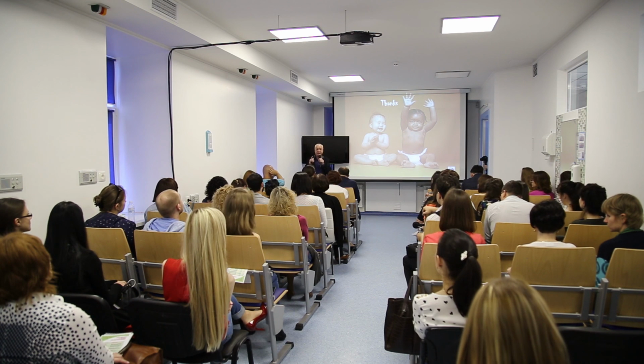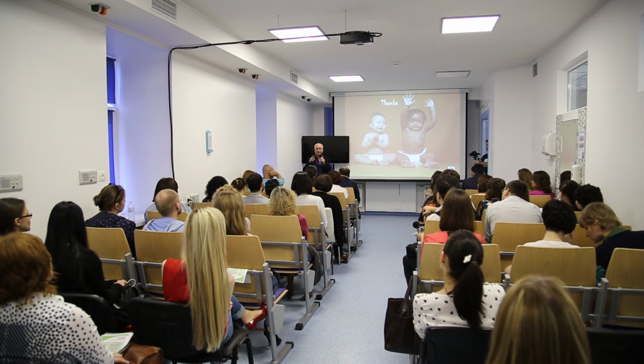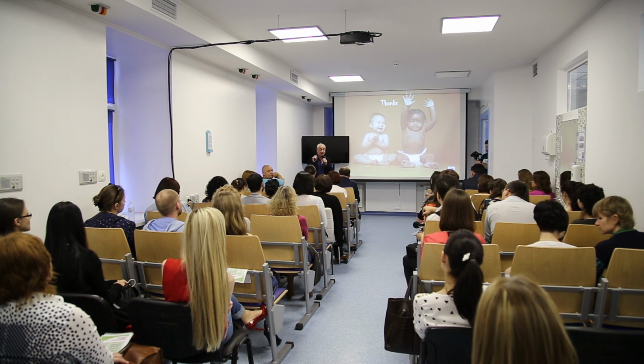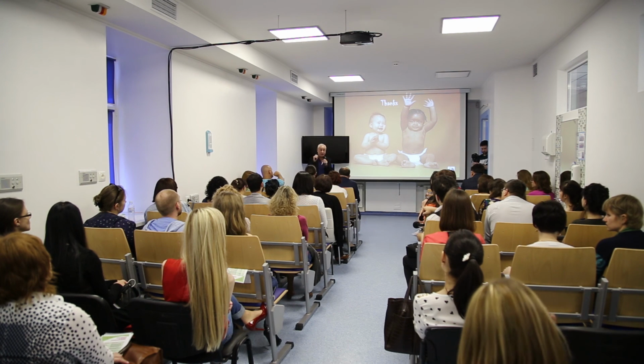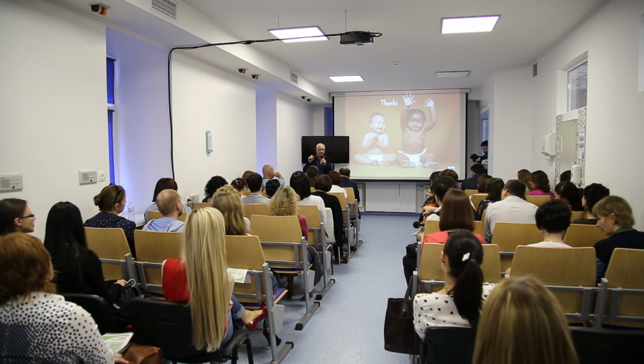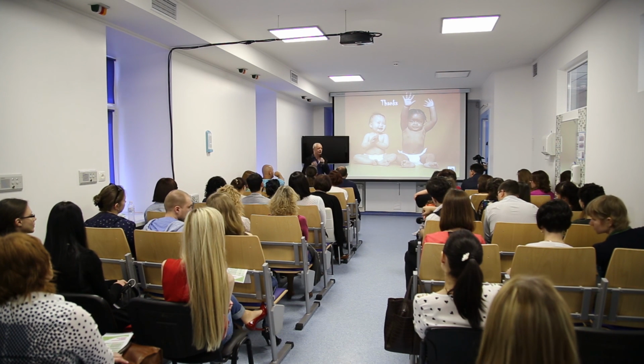And for that, we are working sometimes, as just before with Alexander and Louis here, not in pure PVP, in the bad sperm with low concentration and low motility. We are working with half PVP and half medium. Like that, the sperm have more chance to move outside.